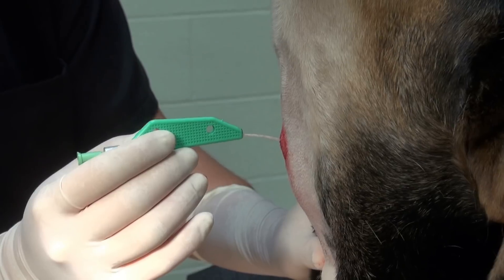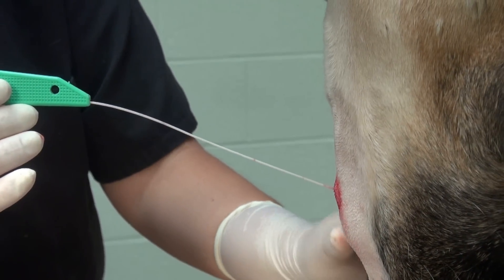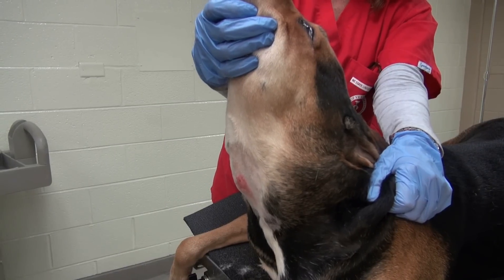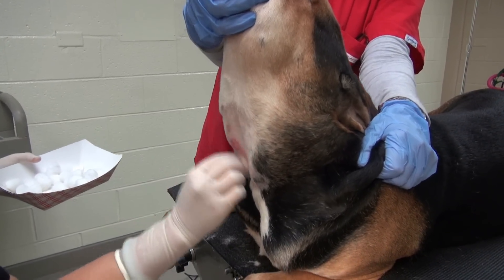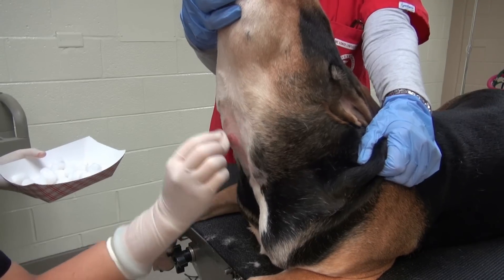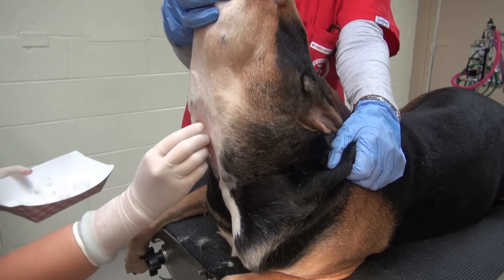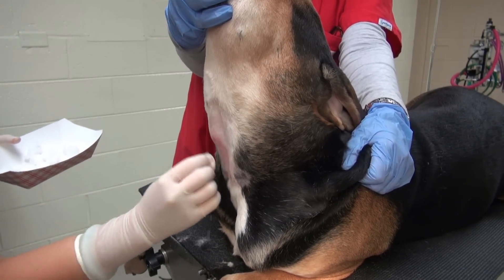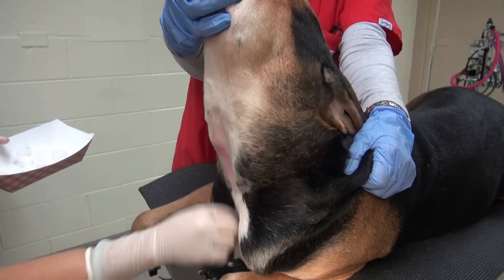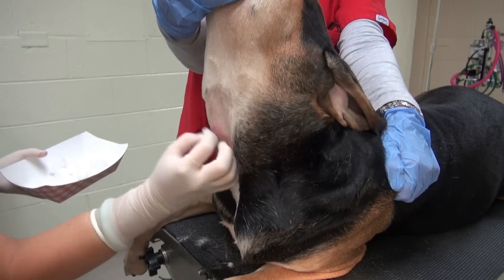If the sample is of diagnostic quality, the procedure is complete. Pull the catheter straight out and apply gentle pressure to the injection site with your thumb. Come back in a few moments to gently cleanse the area with more water, rinsing thoroughly to remove every last trace of soap. Any residual Etiderm left on the skin will contribute to a rash on these dogs.